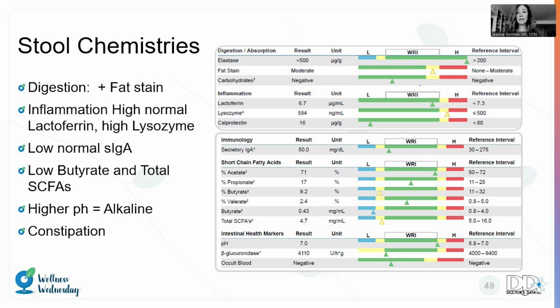And in red, that's appropriate. That's more acute. Over time, if left unchecked, this marker may start to decline. Short of any genetic reason why she's not making secretory IgA, it's being used up in the immune assault that's going on in the gut. It's anchored in the mucosal barrier.